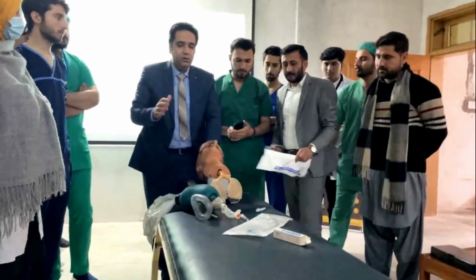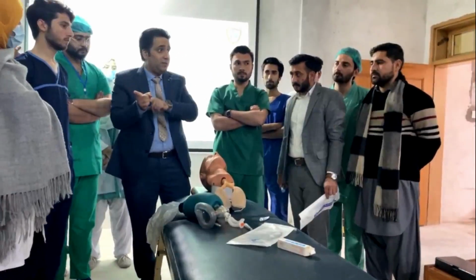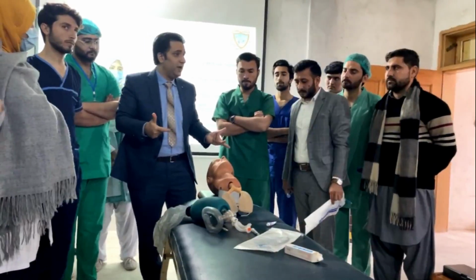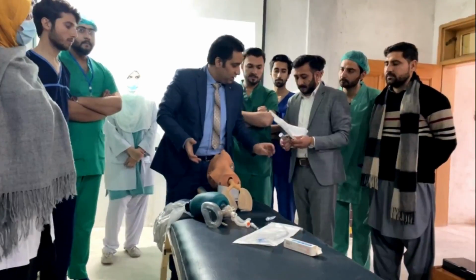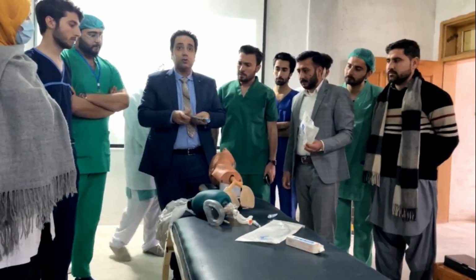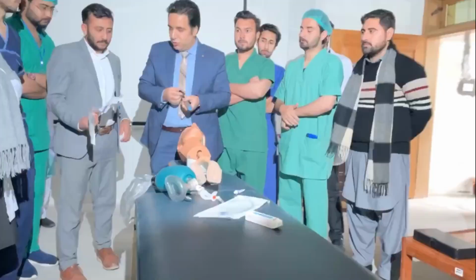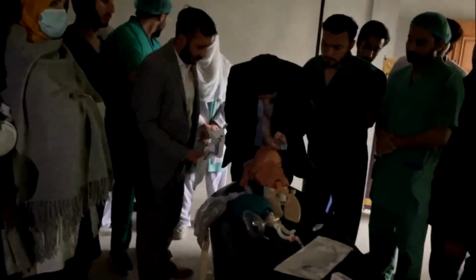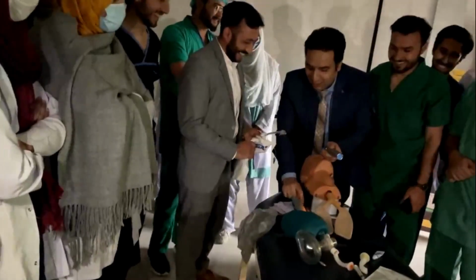What will you do if everything is not working properly for you? You have also called for help, so somebody would have come. Then you will try the intubation method. This is a laryngoscope, an instrument used to intubate a patient. You will enter the laryngoscope for a difficult airway, and it's a very difficult airway, I know it. It's a grade 4. Hold it.